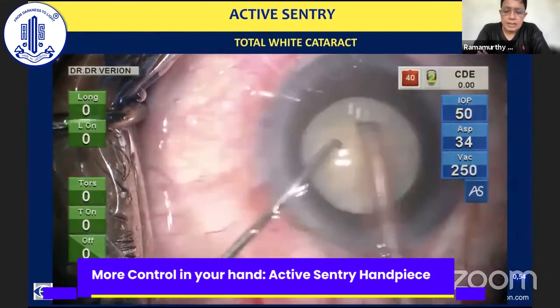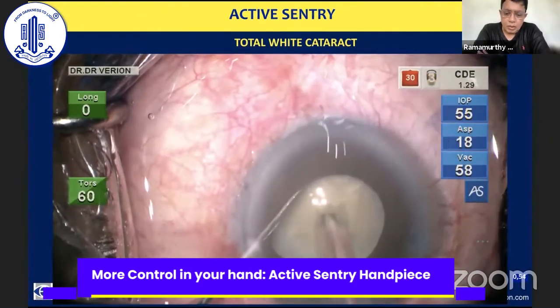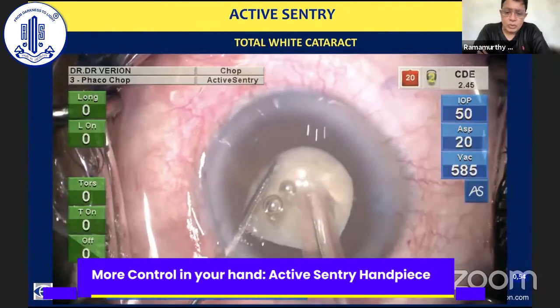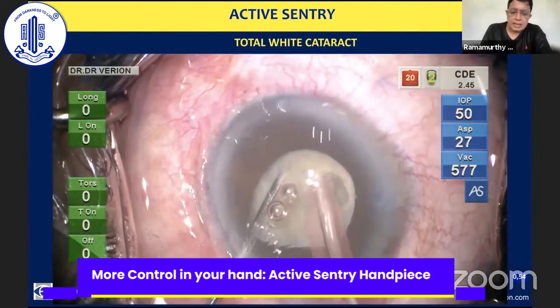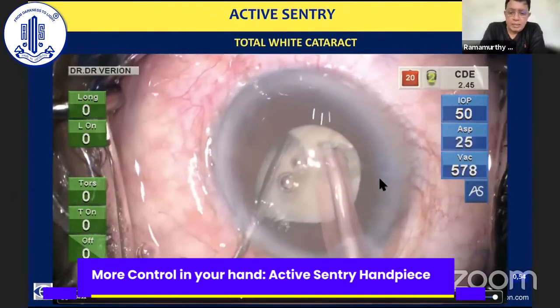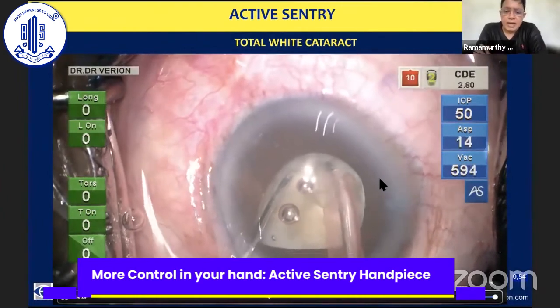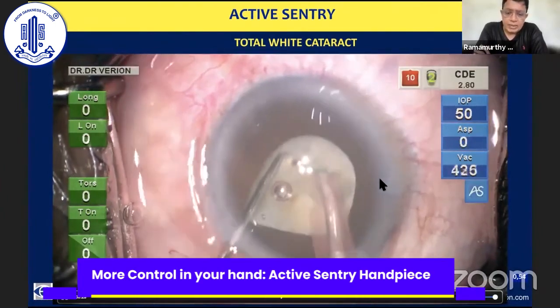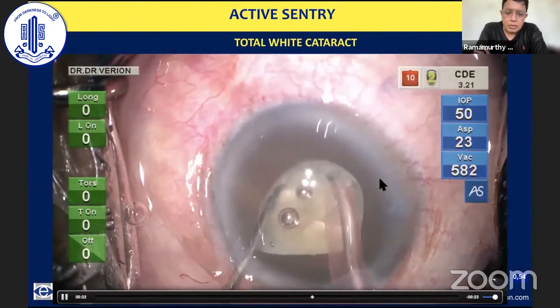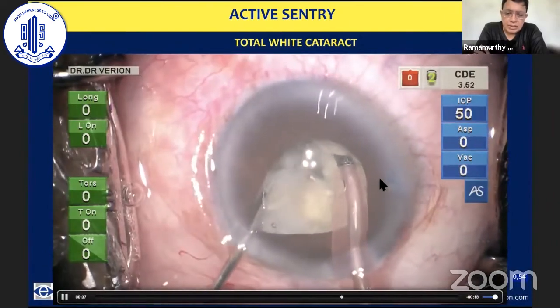Adequate capsular staining is done, and then subsequently I'm removing whatever cortex and epinucleus is there. This trench is something that I do almost routinely. Here you can see I'm using a slightly higher intraocular pressure. You can see there's a PI that has been done here preoperatively, and it's a slightly shallow anterior chamber. Whenever I'm faced with a shallow anterior chamber, I do raise the intraocular pressure beyond the 30 to usually about 50, as you can see in this. The vacuum is kept around 600.